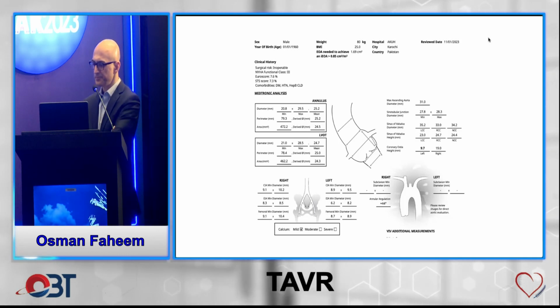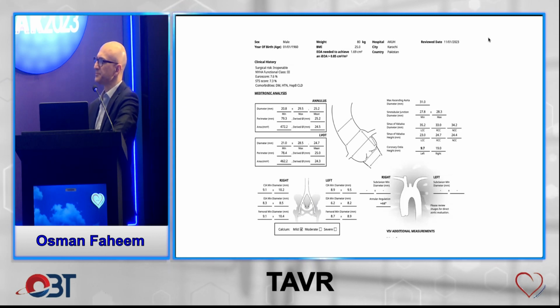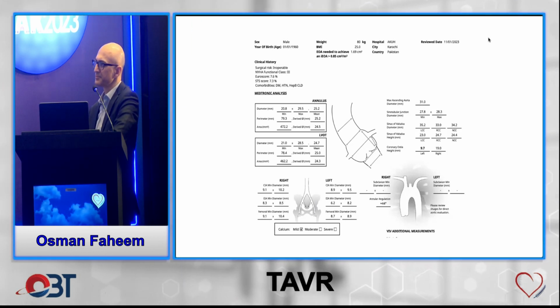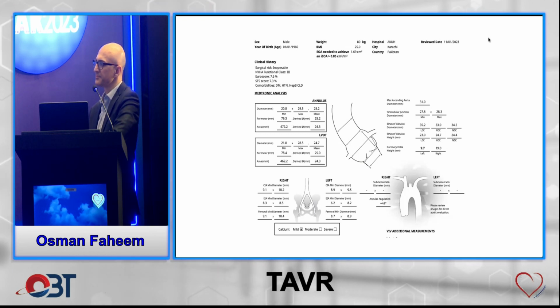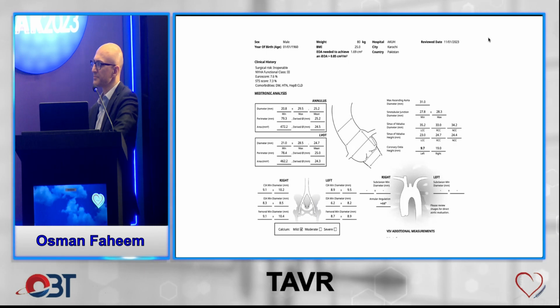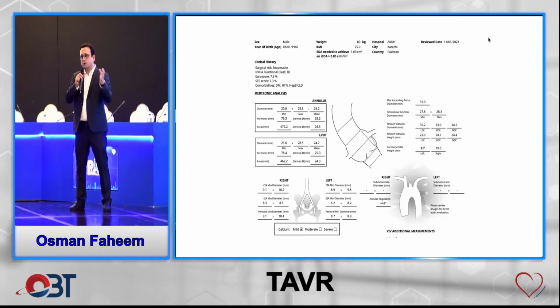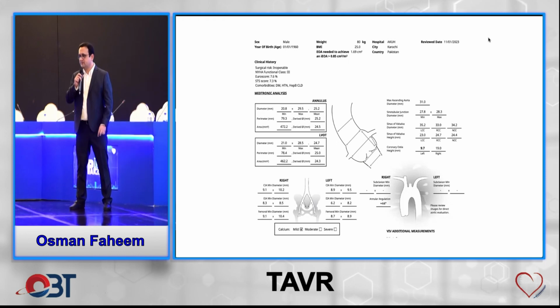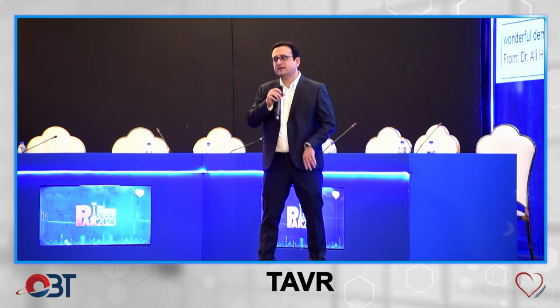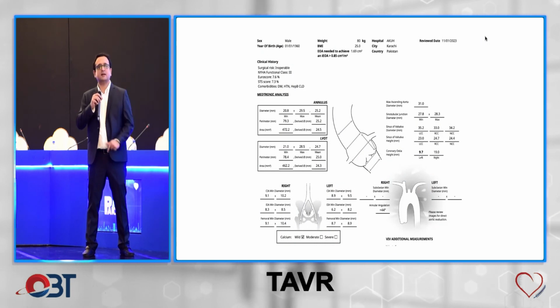When we were doing that training village session, our emphasis was that 70% of the case is essentially your CT TAVR assessment and planning. I think we spent 5 minutes just on this, to emphasize the fact that no radiologist can actually tell you how to proceed with this valve unless you get an understanding of what you're going to do with it. And this is our practice as well, wherever we do it, that before every case we look at the CT ourselves and we analyze it ourselves.